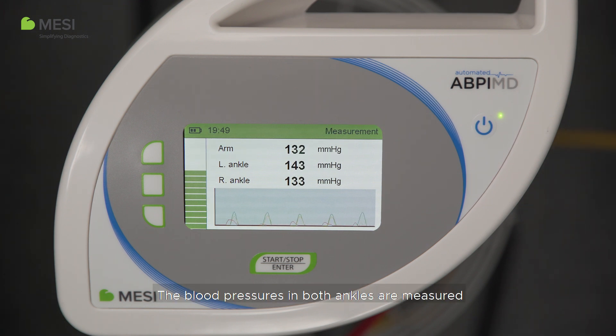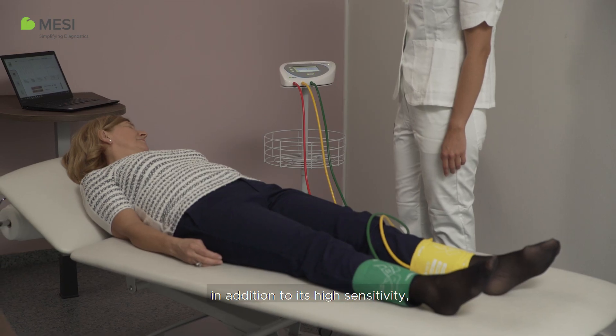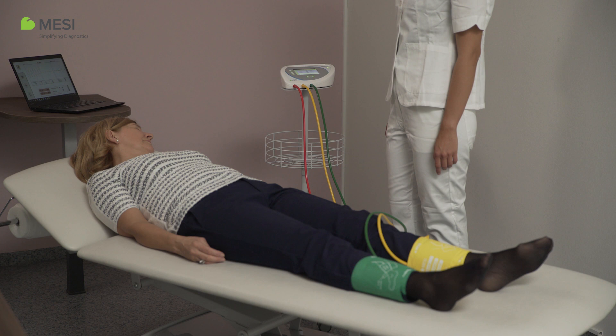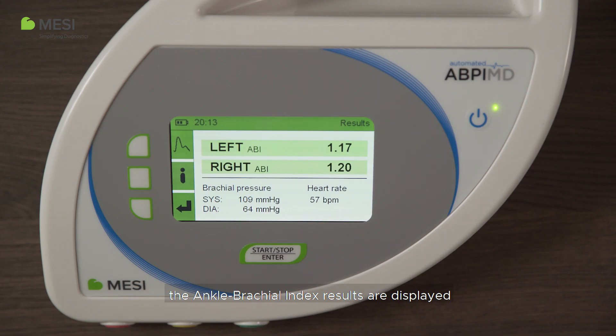The blood pressures in both ankles are measured using the plethysmography method which, in addition to its high sensitivity, takes the difference between arm and ankle anatomy into consideration. After one minute, the ankle brachial index results are displayed in a colored scale that matches the international standard, along with the brachial blood pressure and heart rate.